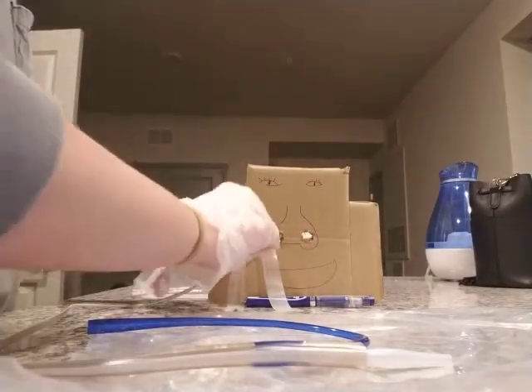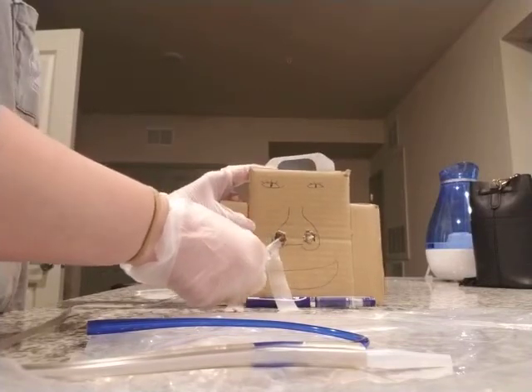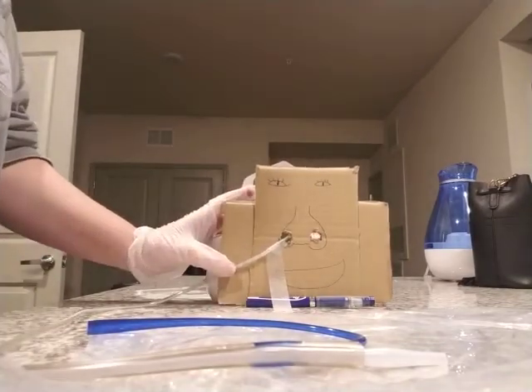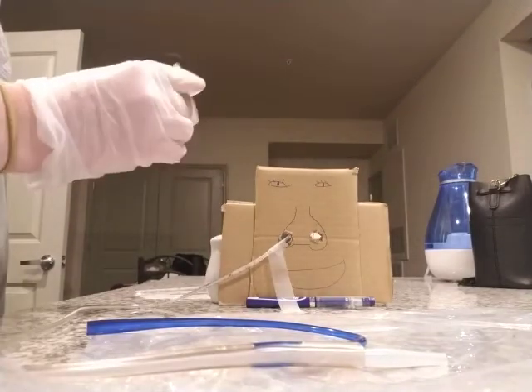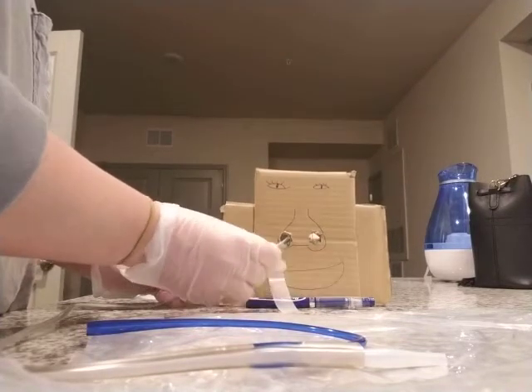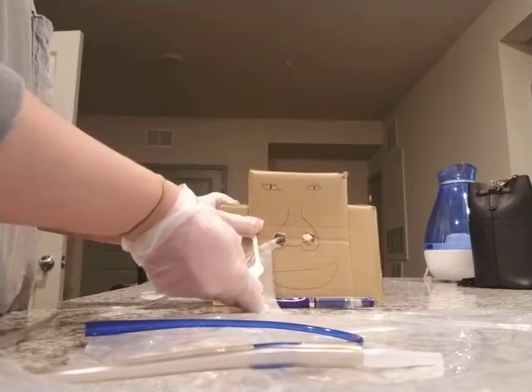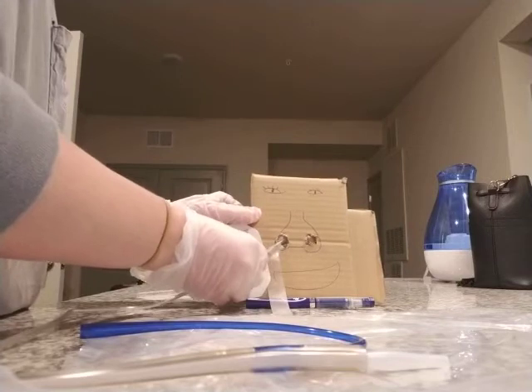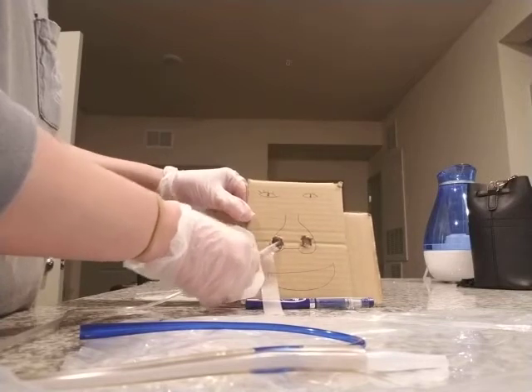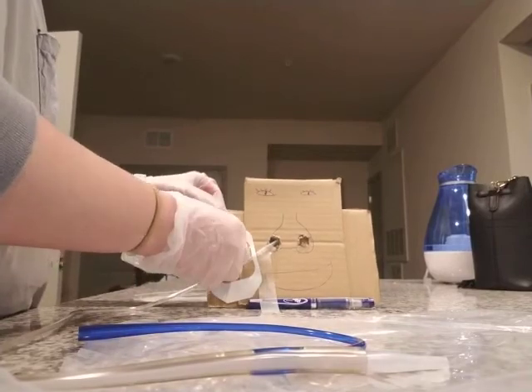I'm going to remove my temporary tape carefully. This Gladys is fragile. And adhere this again carefully because Gladys is fragile. Adhering this out of the patient's sight comfortably. And then removing.